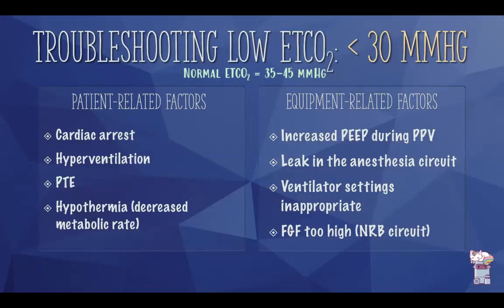When we look at low end-tidal CO2 readings, so hypocapnia, patient-related factors must be considered, including cardiac arrest. Assessing that your patient is alive is one of the first things to troubleshoot when you have a low end-tidal CO2 reading. Hyperventilation can also decrease your end-tidal CO2 reading.